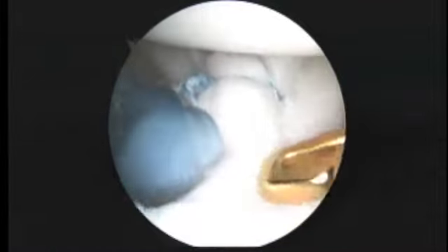Okay, so there's our first mattress stitch in the front compared to where we were in the back. 2 in the back, 1 in the front. 6 o'clock is down here. We're looking from the top towards the bottom. So now we're going to bring this back a little bit. And that tightened, you can see how that tightened the anterior band of the inferior glenohumeral ligament, the IGL, which is the most important ligament in shoulder stability.